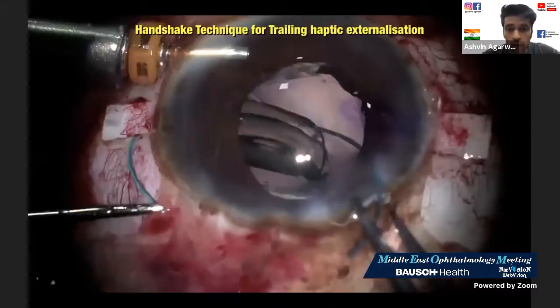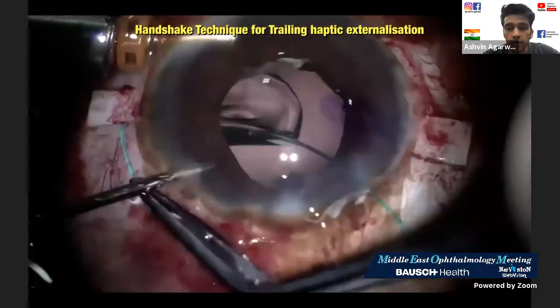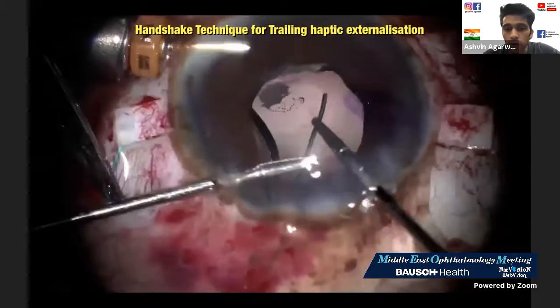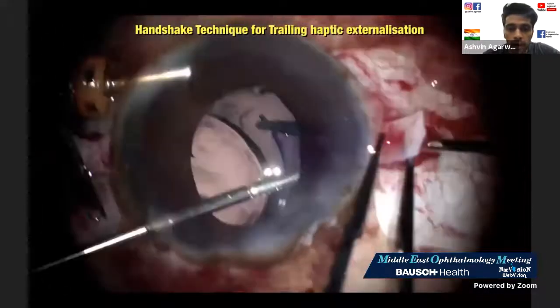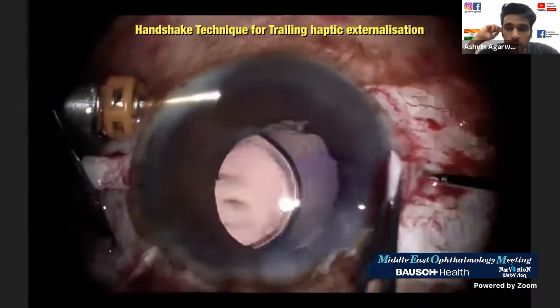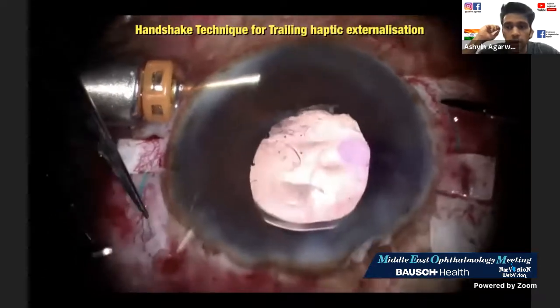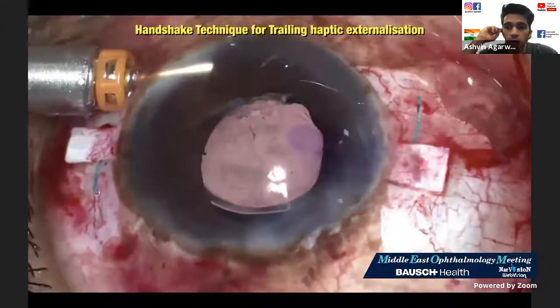What I do next is my handshake technique. So I first straighten this out. Once I've straightened it out, I insert this into the eye, handshake to my left hand, then through my right hand, go back through the sclerotomy on the right side, and grab the tip of the haptic. Very important: if you grab anywhere in the middle of the flange, it will break. Now, this is a very important point for everybody to see. See the amount of haptic I have externalized because I went 0.75.